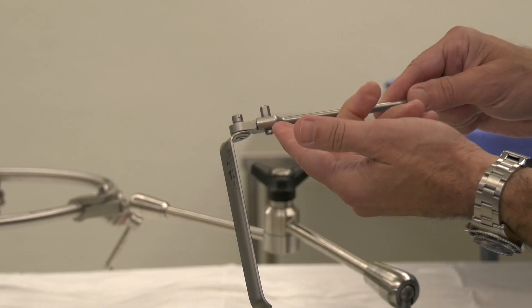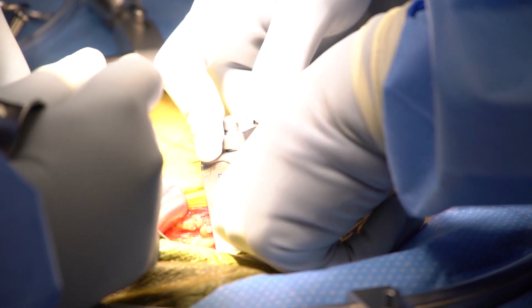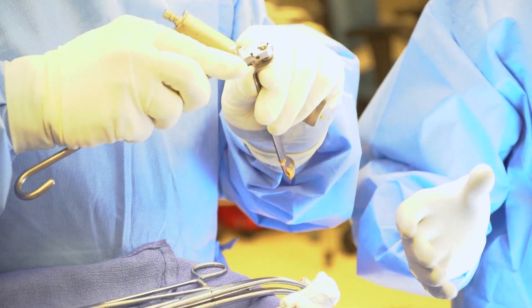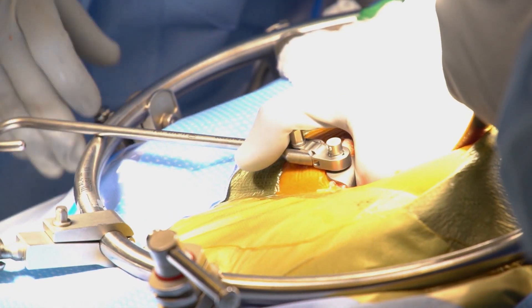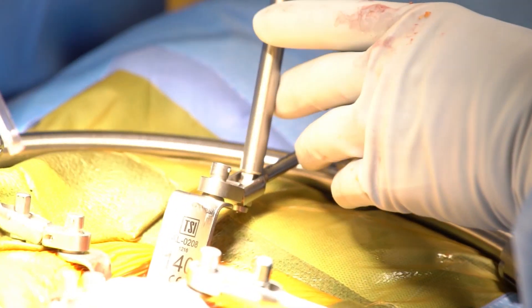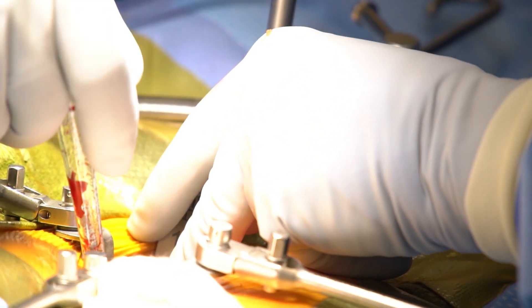Once you determine the length of your blade for your operation — which is necessary based on the patient's body habitus — you're going to place the blade in, you're going to snap it into position, and then lock it down. For example, on an L5-S1, typically this one I would have angled to a little bit higher degree of angulation.